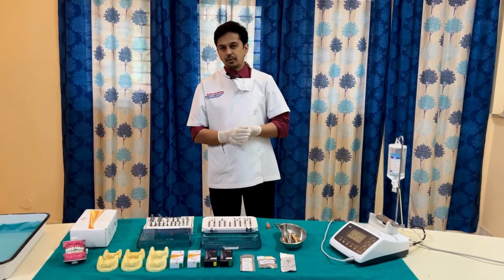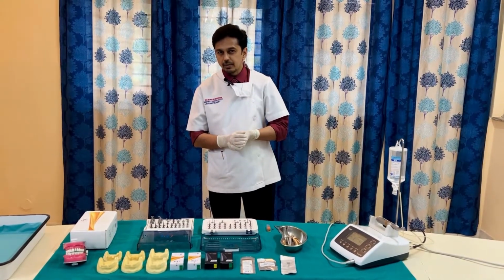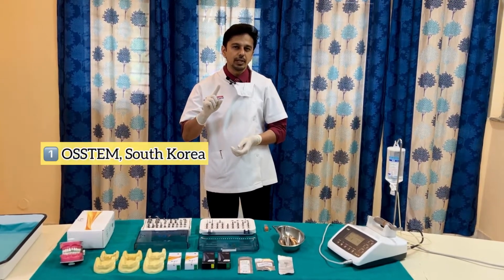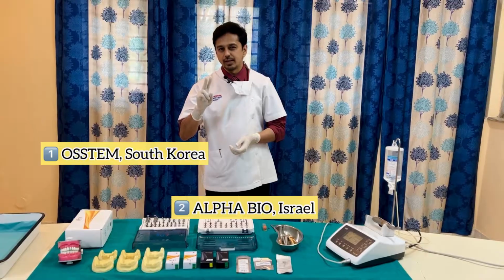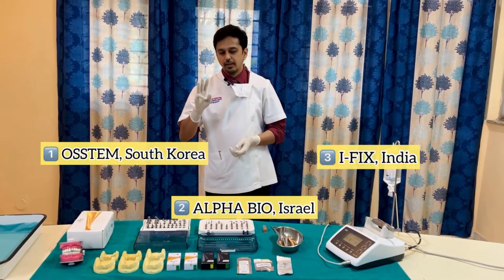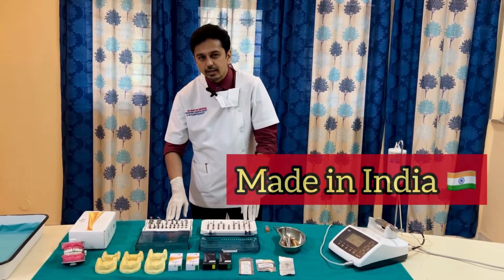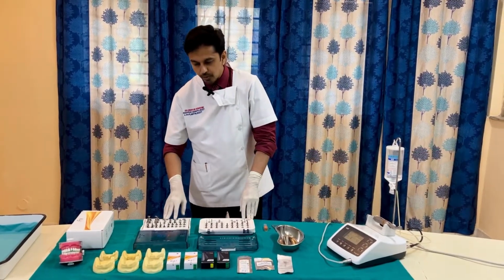So in the last video, if you remember right, we had covered implant kits of 3 different countries: Ostem from Korea, Alpha Bio from Israel, and iFix from India. Today's video would be focusing basically on the Indian kit, the Made in India kit iFix. So we'll be demonstrating this.